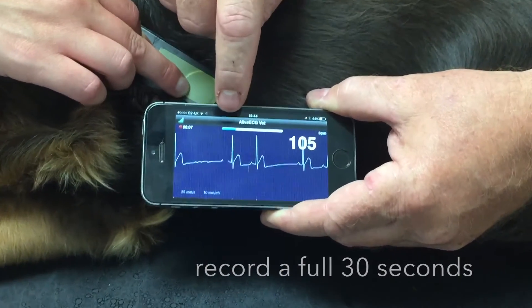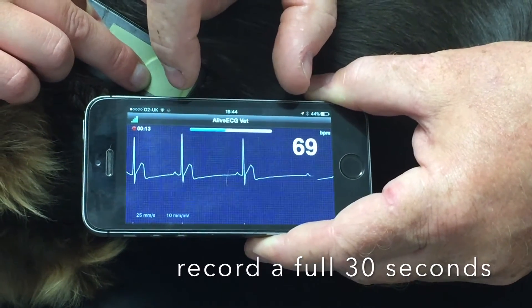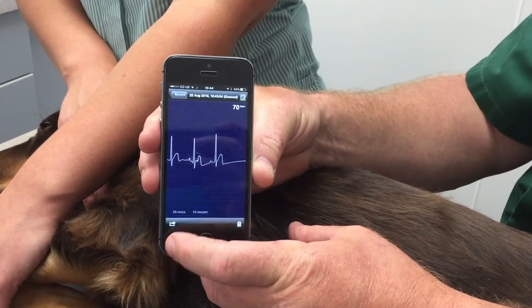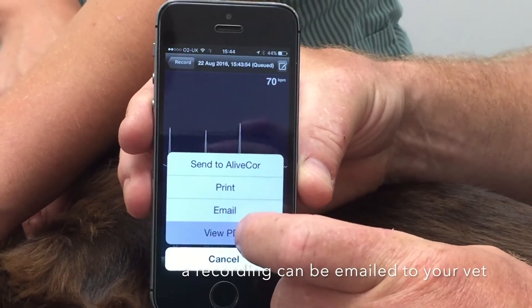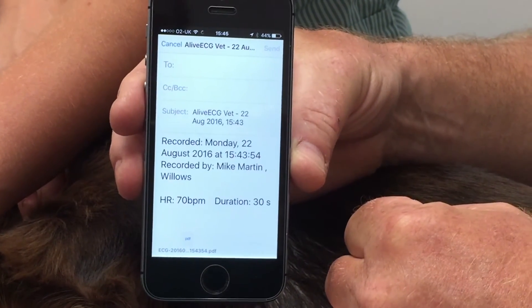The blue bar indicates the filling of the memory. I've preset mine to 30 seconds, which is what I'd recommend in your settings. Once completed, the name of your pet can be added and sent as a PDF, as an email, to your cardiologist or veterinary practitioner.